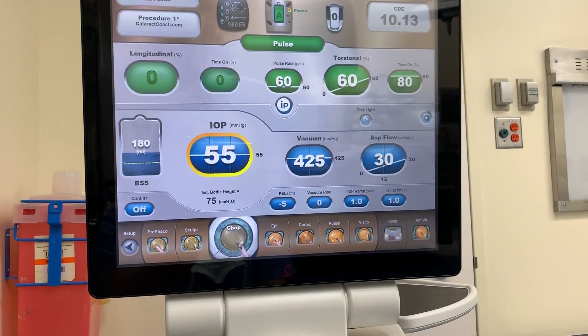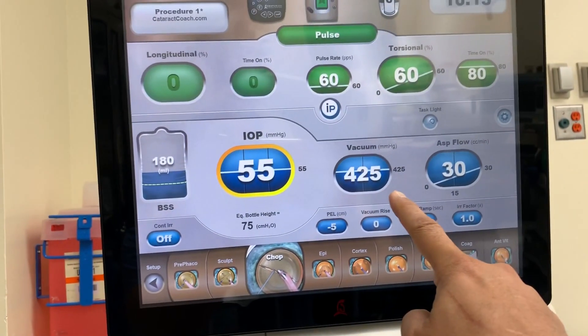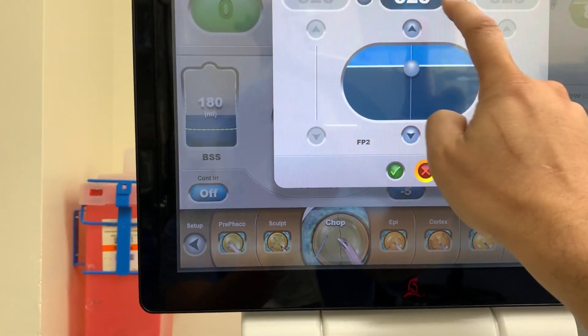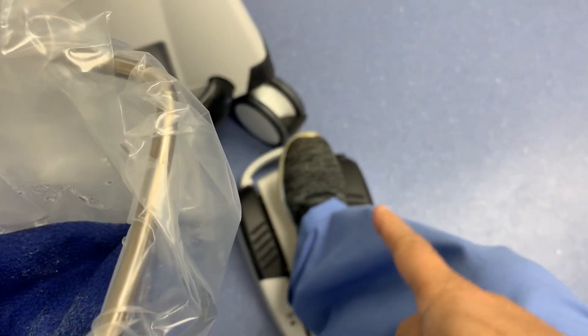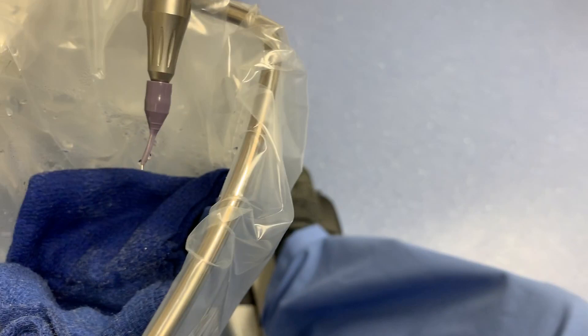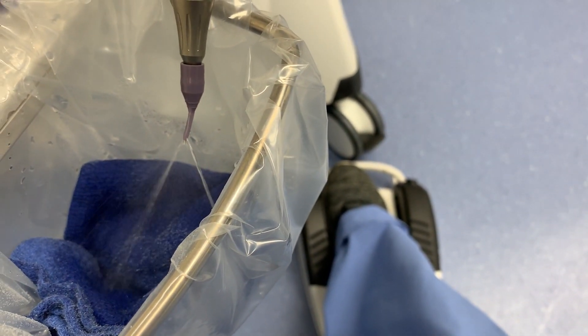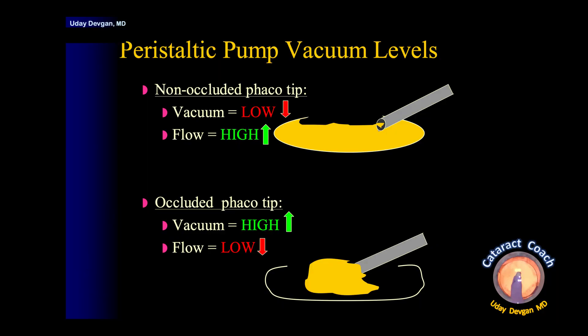For a machine with a peristaltic pump, even if the vacuum is set to 425 mmHg, or even higher at 500 mmHg, will we achieve that if we put the pedal all the way down? The answer is no. The pedal is all the way to the ground, yet the FACO tip, because it's not occluded, fails to generate high vacuum. So with a peristaltic pump, if the tip is not occluded, you will not be able to achieve the high vacuum despite the preset.